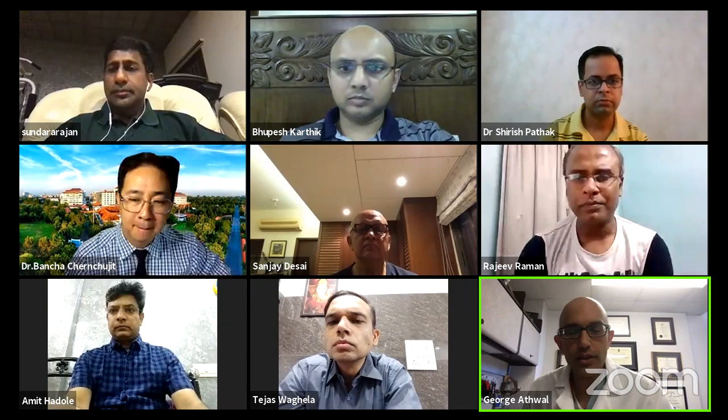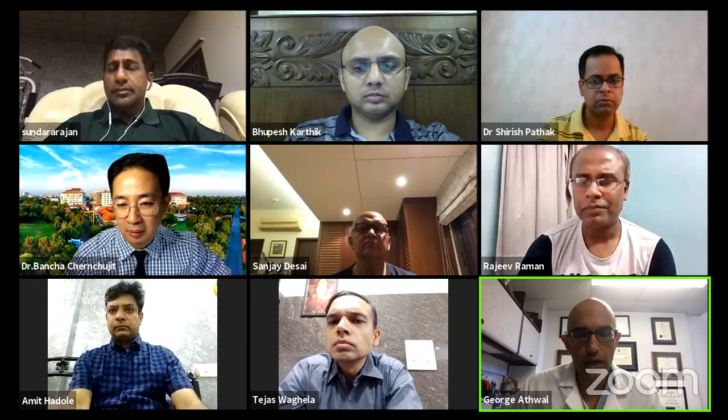I mean, I think if you follow the literature, it doesn't matter. In majority, over 80 to 90% use single row, and I've been happy with it. I just stagger my anchors, I'll show you here. Am I screen sharing still? No. You can share and show.